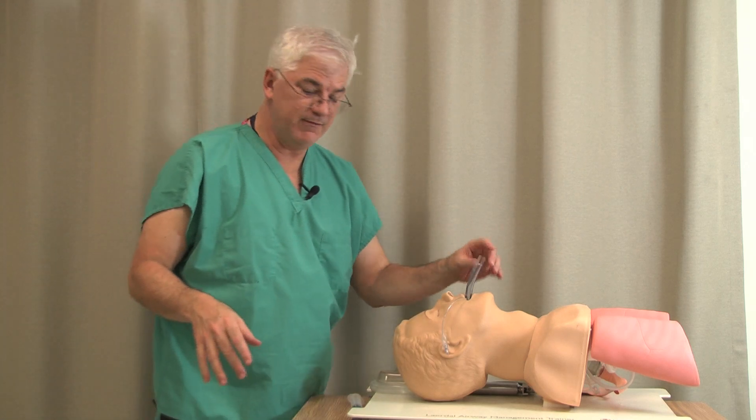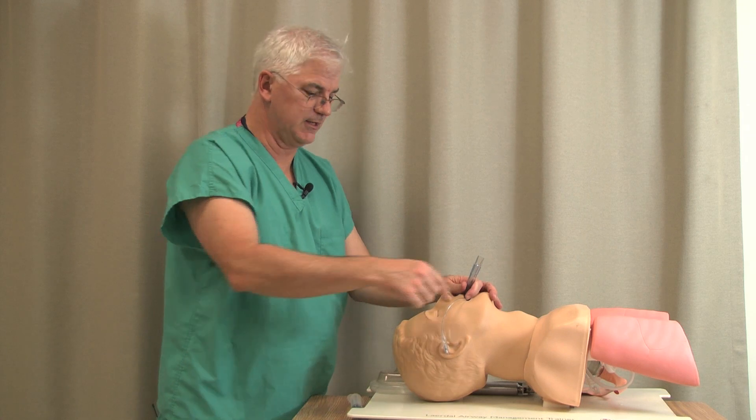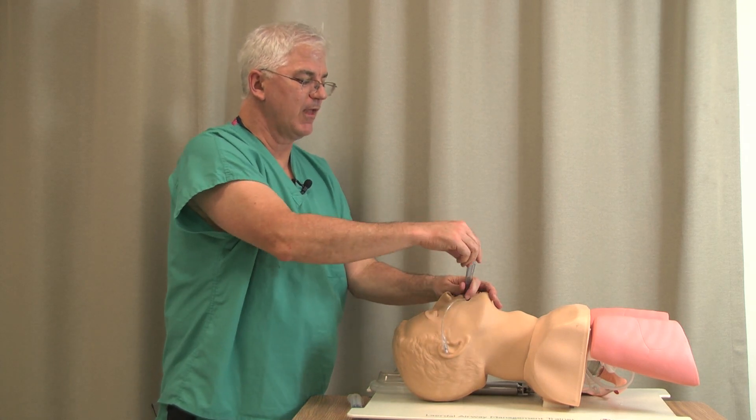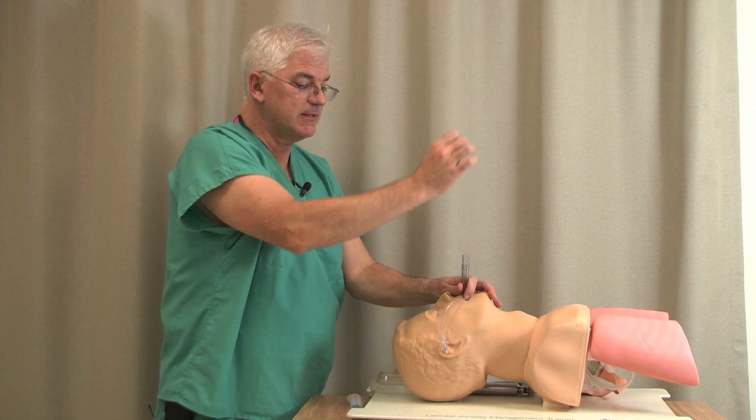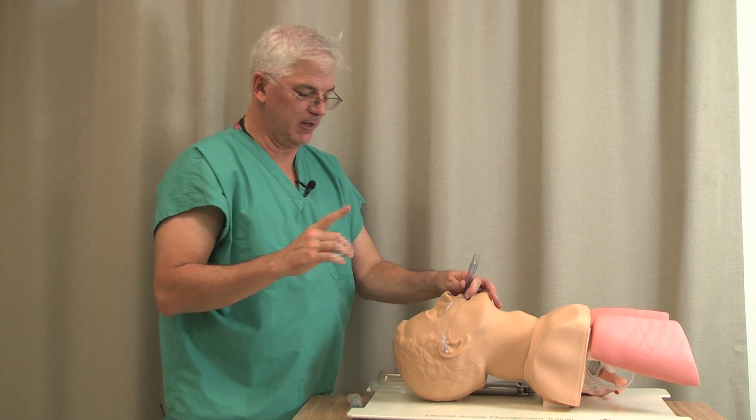Since you're looking for the more definitive thing, you can do a fiber optic through this — that will be discussed in the section on fiber optic. You can also pass an endotracheal tube blindly through an intubating LMA.